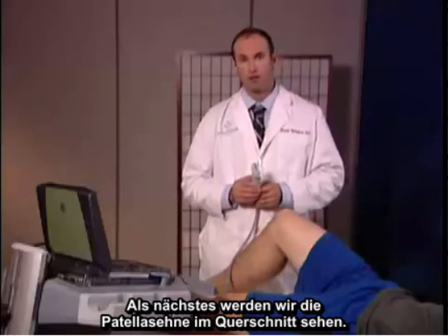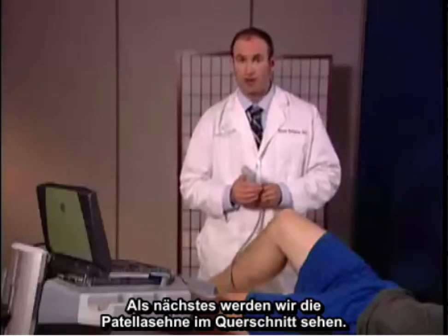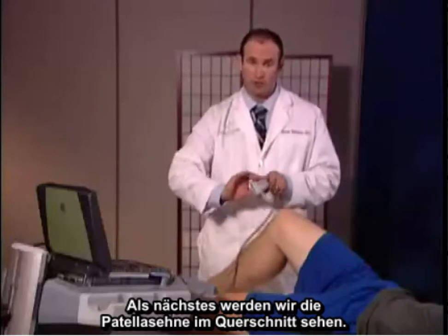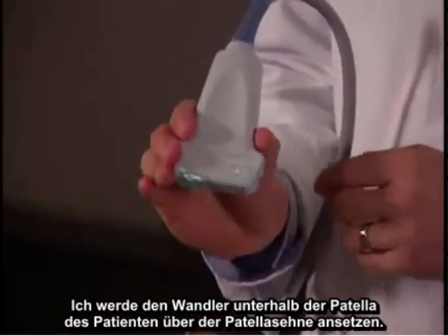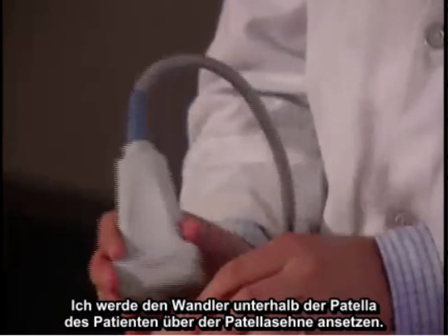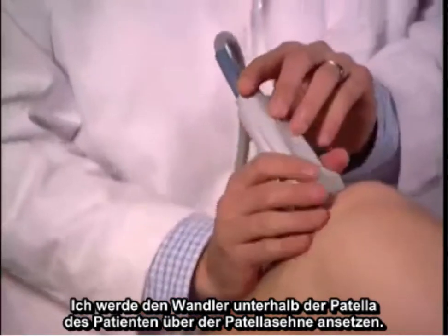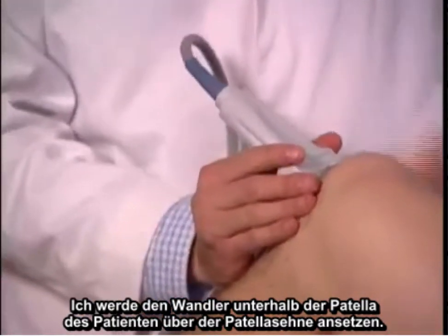Next, we're going to view the patella tendon in cross-sectional view. I'm going to place the transducer beneath the patient's patella, just overlying the patella tendon.